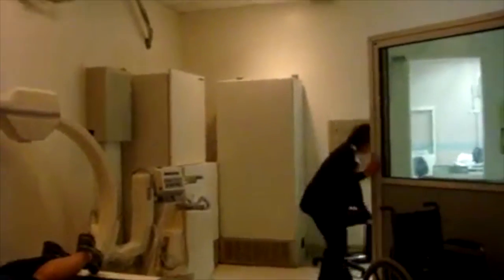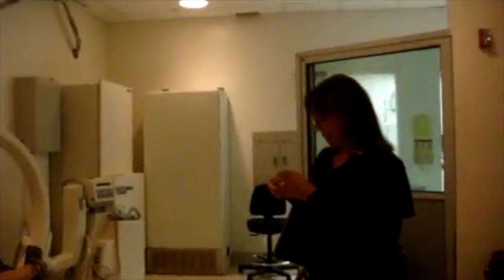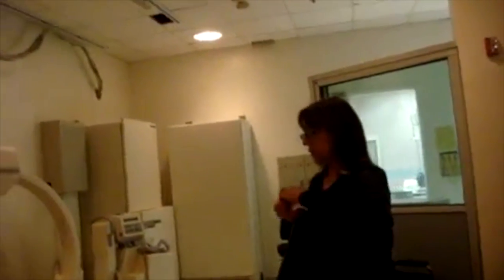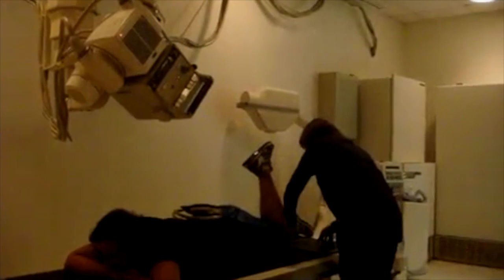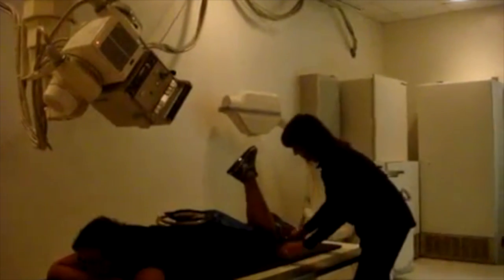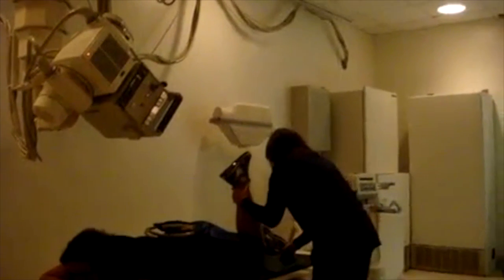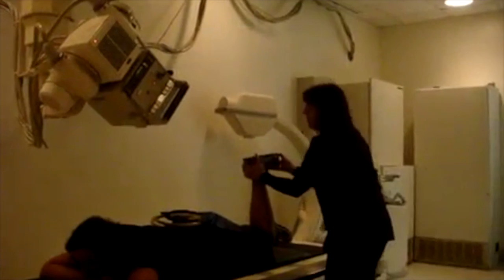I'm going to grab a new plate. And now my projection will be a tangential projection, Settegast method. For this projection, I'm going to have my patient flex the knee 90 degrees, placing the IR. I'm going to have you lift your knee up. Thank you. Go ahead and place it down. 90 degrees, a little bit more please. There we go. You keep your foot flexed. Very nice.